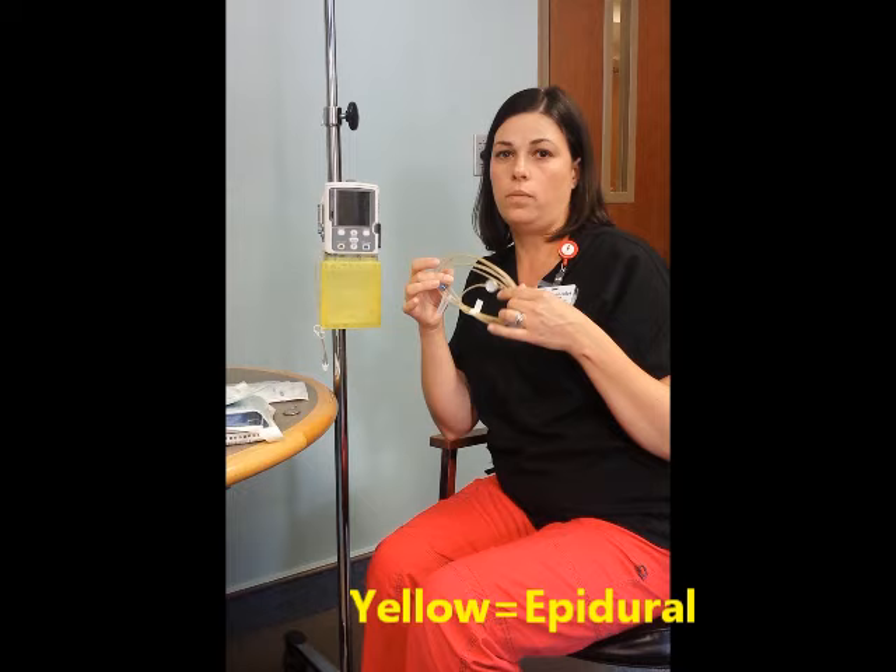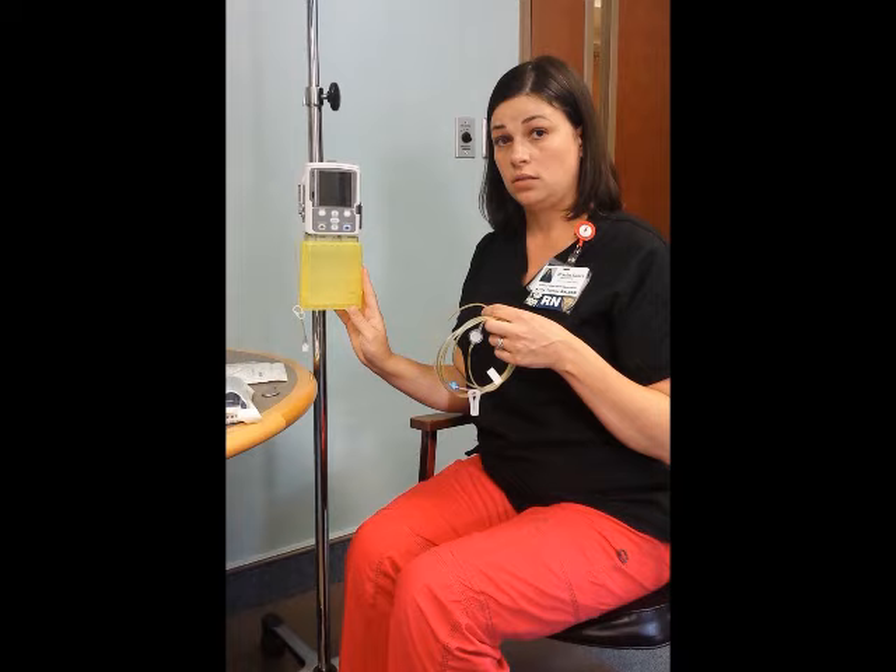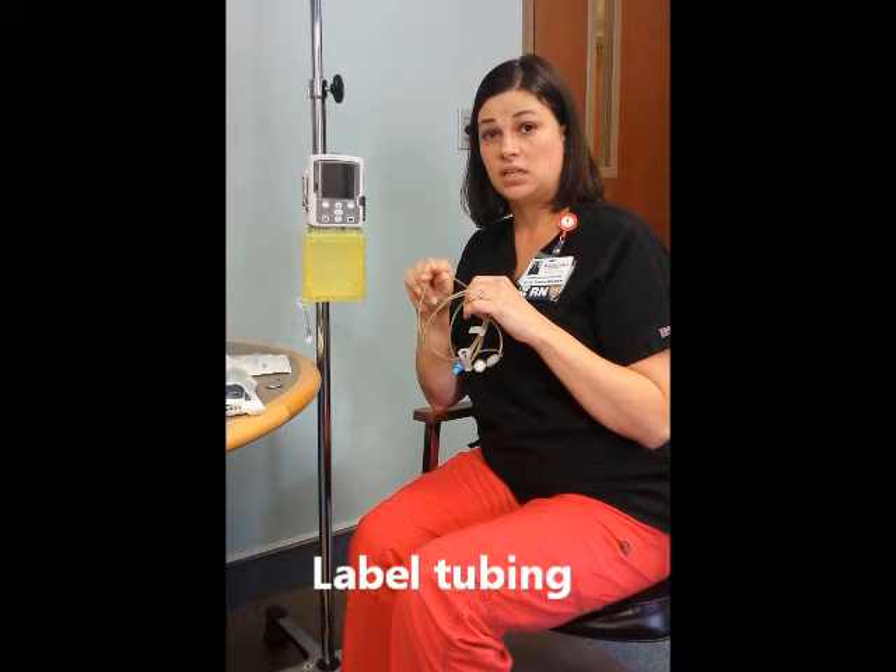The tubing for both are good for 96 hours. When your patient comes up from the floor, the pump will already be programmed and running, and the tubing will be primed. So nurses, when you get your patient, grab one of the IV stickers that we use as reminders — stick it on your tubing so you know when your 96 hours are up.